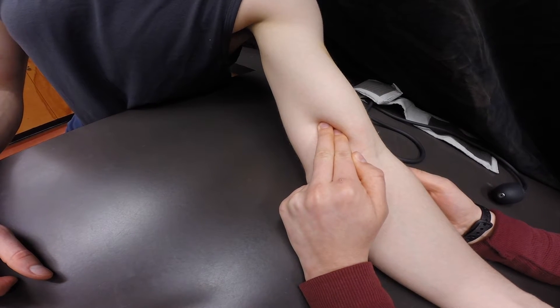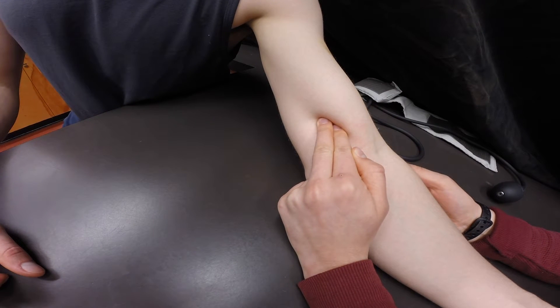Have them place their left arm on the table and palpate the brachial artery. You should be able to feel it just under the biceps, and you can mark it with an X if you want.